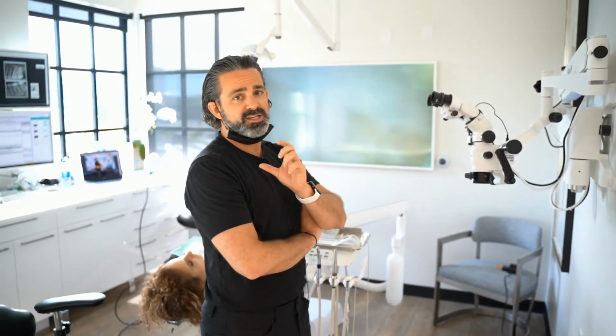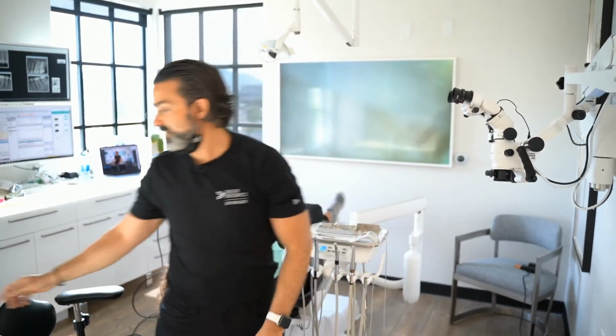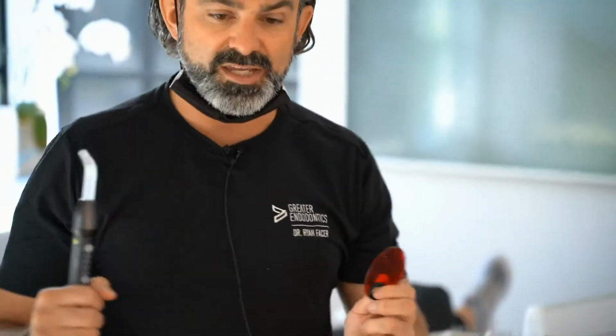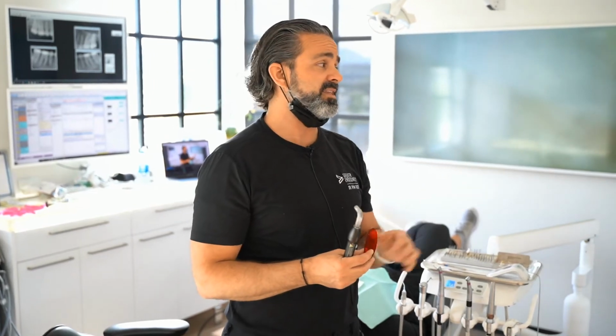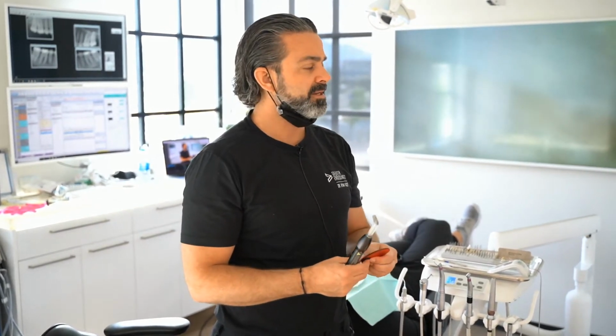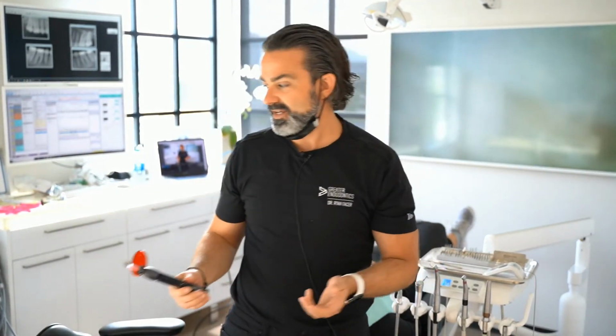But when it comes to actually seeing and doing the dentistry, not having these filters put in front of your face, being able to control them on your microscope, and the ability to articulate that puppy any way you want in any direction is great. I still do indirect a lot with a mirror, so the microscope isn't taking indirect vision away from me. That was never an intent in my mind, but I can position and hold it, and if I need to move to another room, it's still there when I come back. Those are really good assets to the microscope.